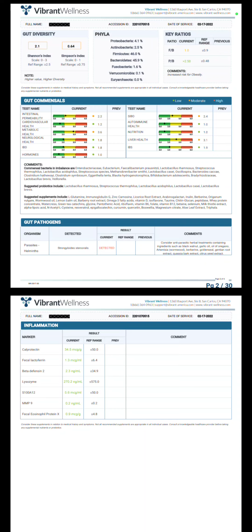And then underneath the gut commensals, you see these green, yellow, and red bars. Now, this is not diagnostic, but it does let us see trending patterns based on the bacterial balance within the gut microbiome. So it gives us some indicators of where we might want to look more deeply, but again, it's not diagnostic. Underneath gut pathogens, this is where we look for parasites. So this particular person does have a parasite.